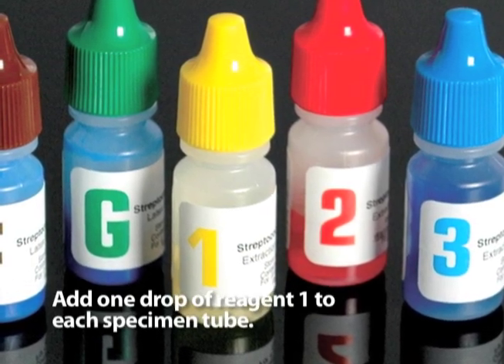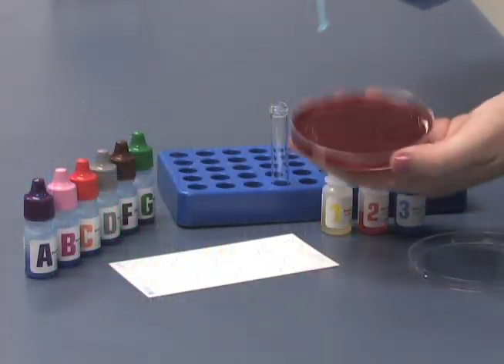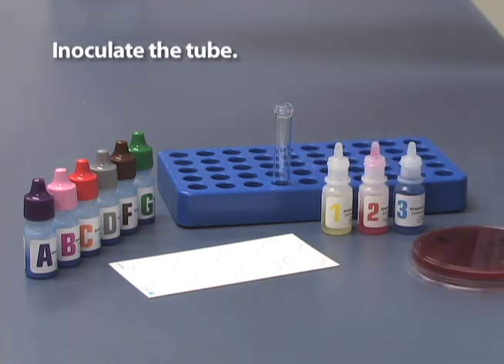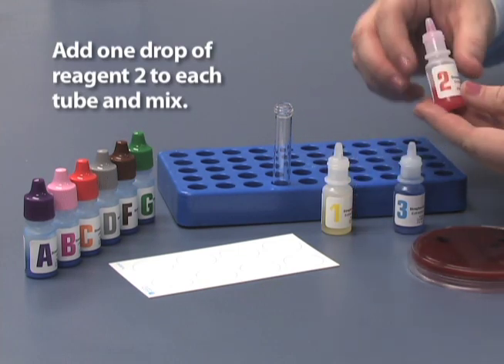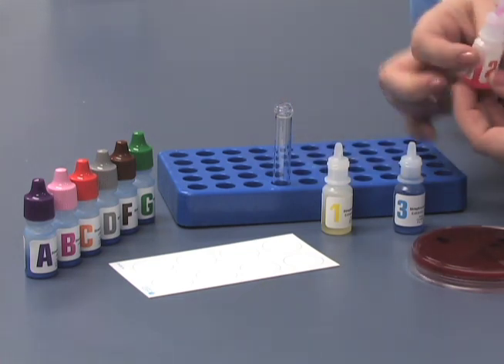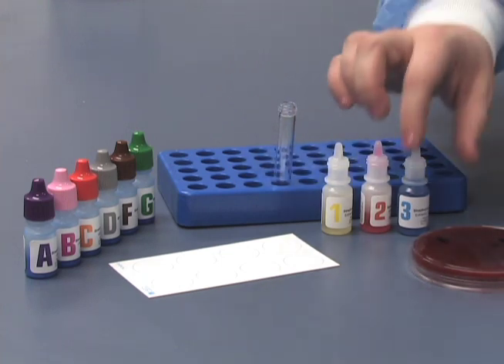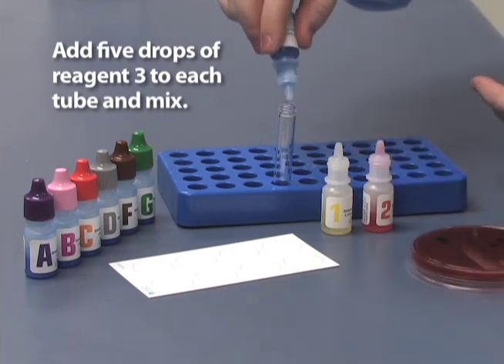Add one drop of Reagent 1 to each specimen tube. Select one to four colonies from an overnight culture. Inoculate the tube. Add one drop of Reagent 2 to each tube and mix. Now add five drops of Reagent 3 to each tube and mix.